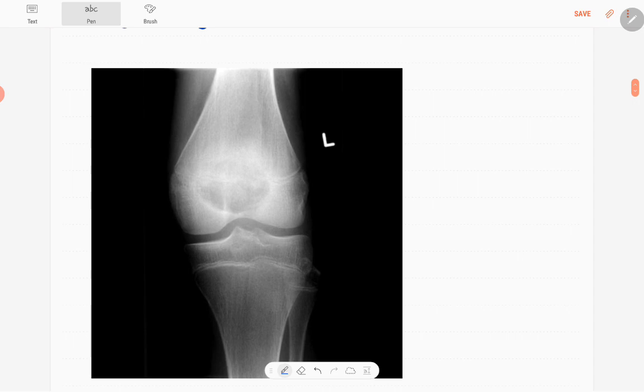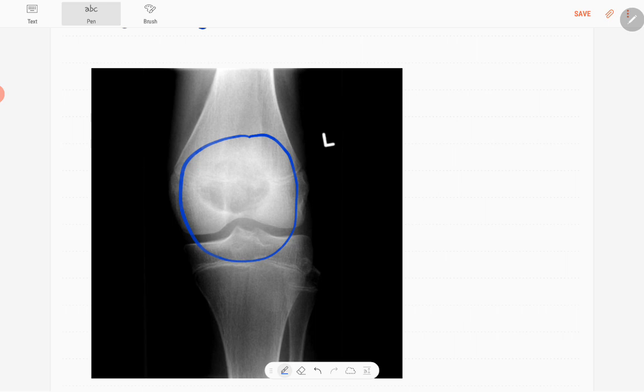The obvious abnormality is this region. It's a well-defined rounded lytic lesion located in the epiphysis.